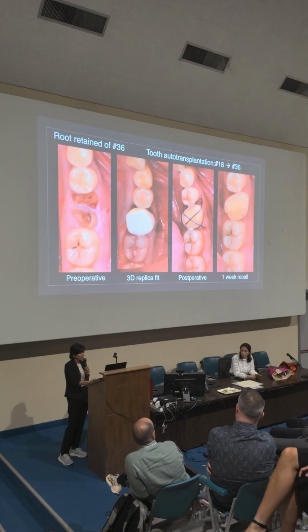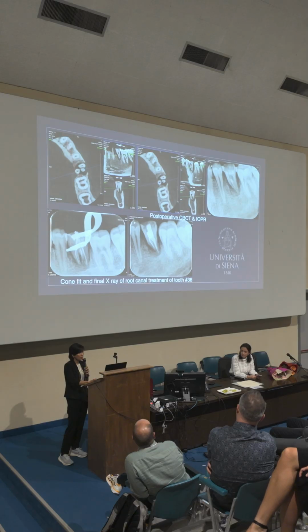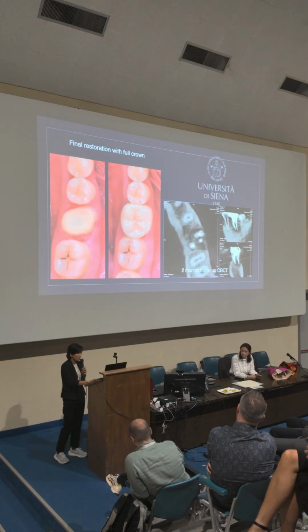And this is the clinical image after 1 week. And this is the CBCT post-operative. And after 2 weeks, I did the single visit root canal treatment and followed by the full crown restoration. And this is the 2 months follow-up CBCT.